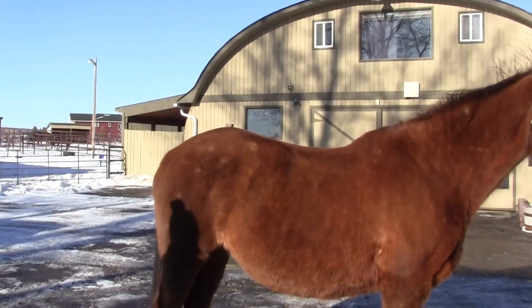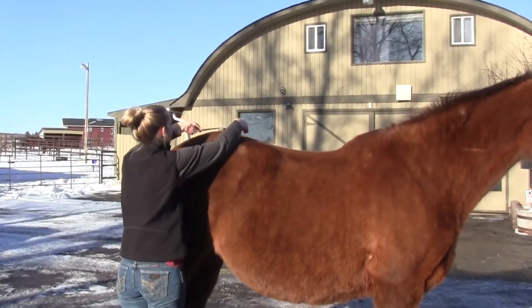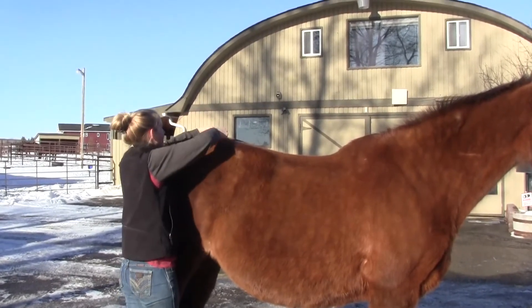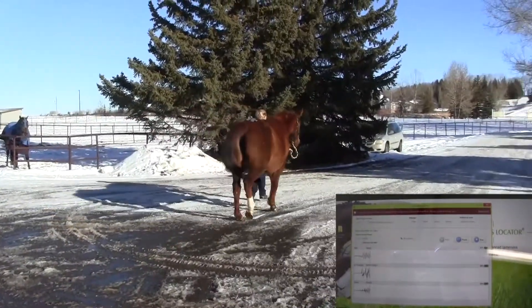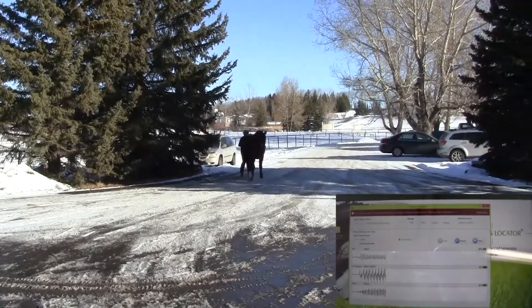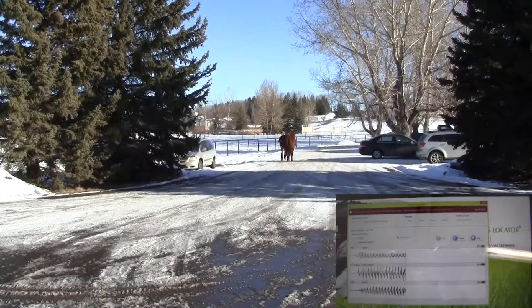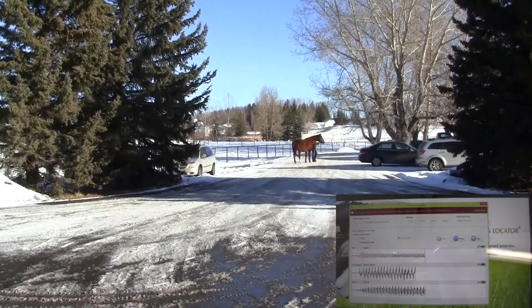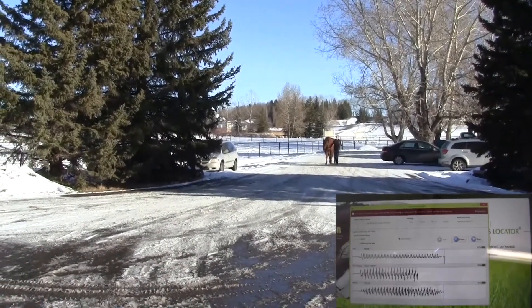We put it on the majority of lameness exams we do because it's helpful for figuring out a lot of different things. If the horse has multiple lamenesses in different legs, it'll help sort that out — including distinguishing a compensatory lameness from two truly different lamenesses. If the lameness is quite subtle, the sensors can pick up a lameness about ten times more subtle than we can see with our eyes.